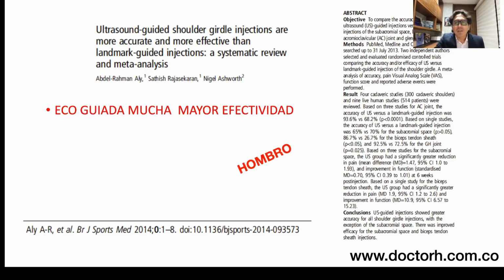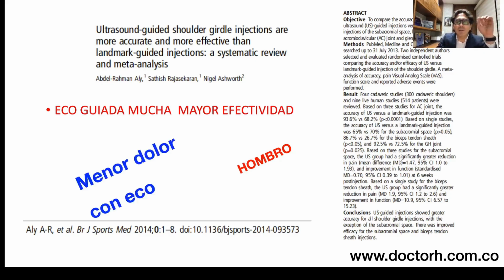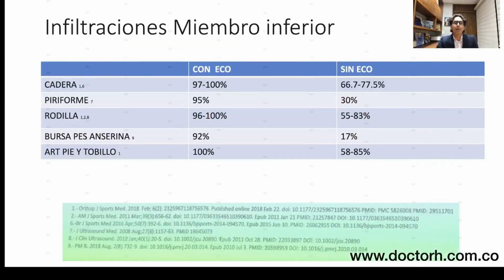And what about the patients? How do they feel? We're also looking for, and there are actually studies like this one that show, for example, that when ultrasound is used, not only is it more effective, but there's also less pain. This translates into quality and benefits for our care and for the patient's perception. Less pain. Besides that approach, it's worth continuing.